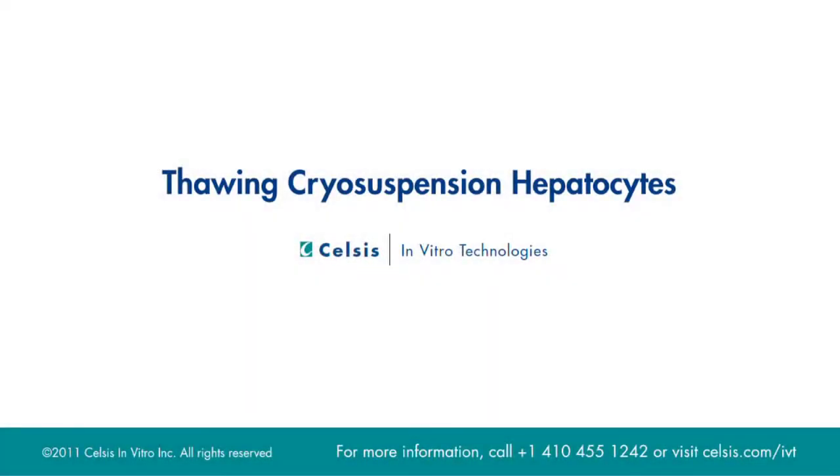Today we will be thawing cryosuspension hepatocytes. These products are ideal for metabolism and transporter studies.